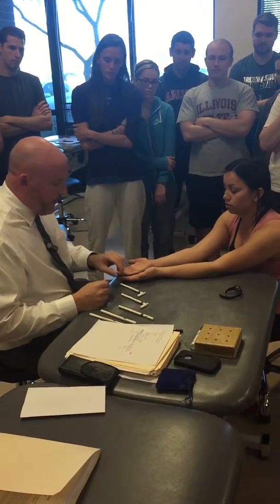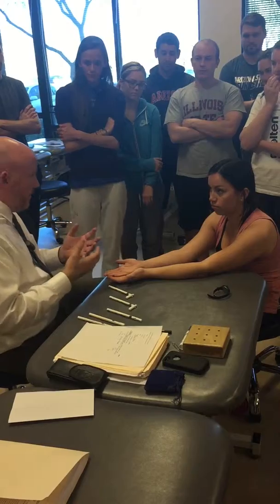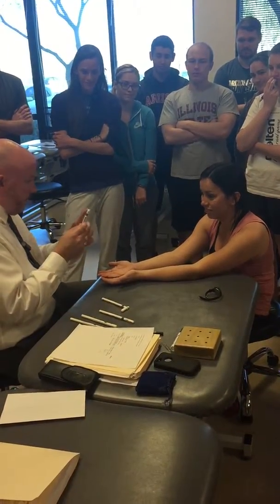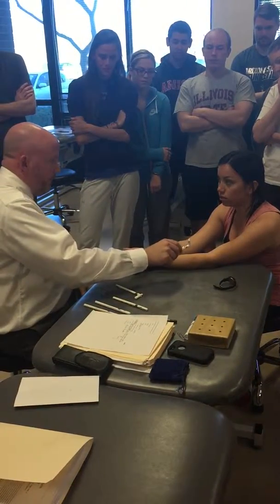So she has her hands right here. And if we're dealing with symptoms in the left hand, I'm going to ask you to close your eyes. And before you do, I want you to feel this. I'm going to take this little monofilament, okay? It's not going to stick you like a needle, but I'm going to tap against your skin. Do you feel that sensation?